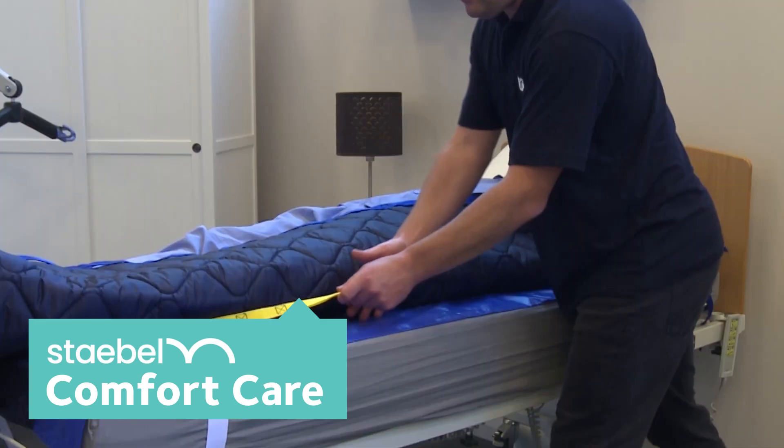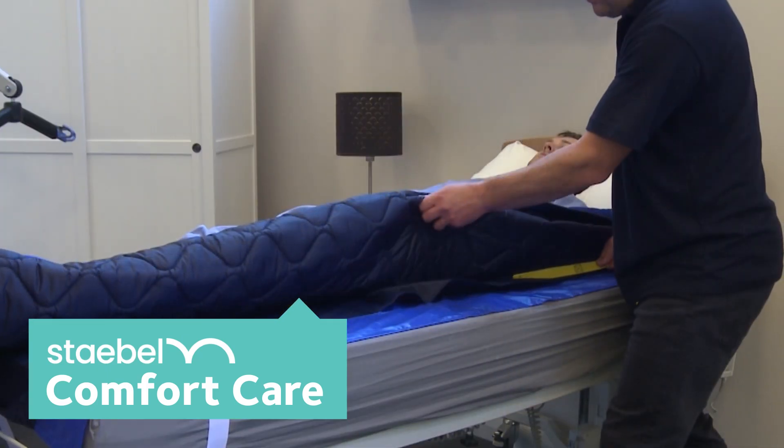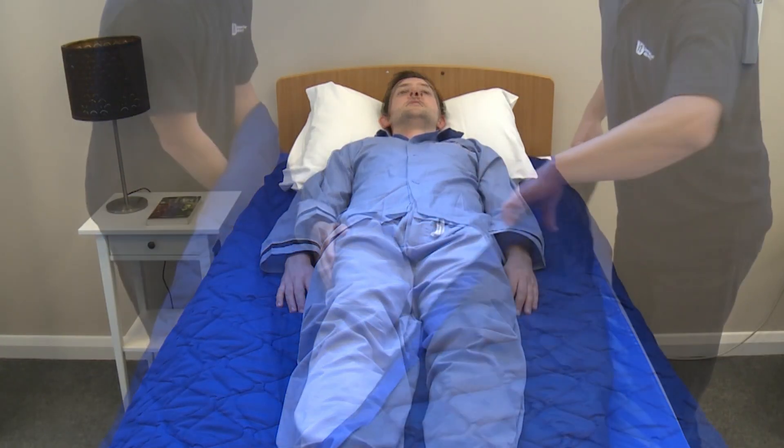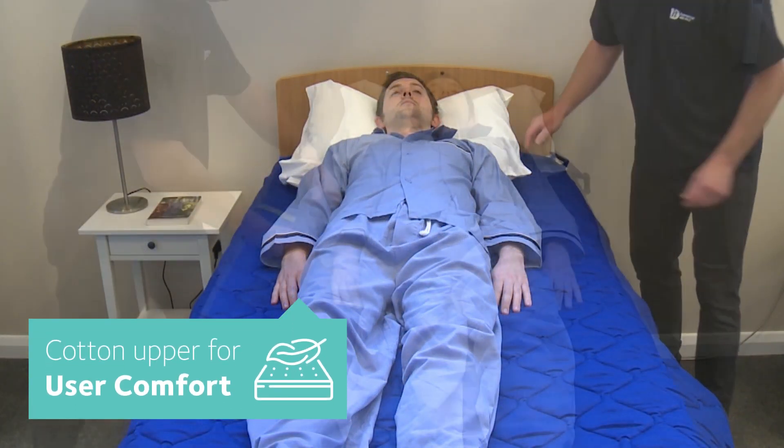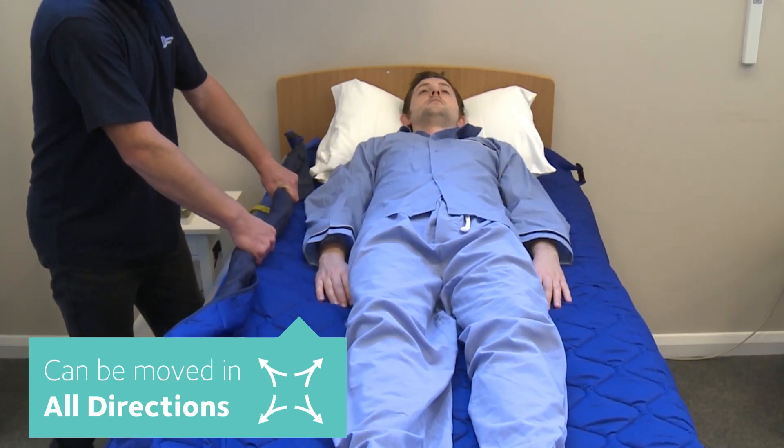Before moving a person, you must ensure the base cover is slippy. To do this, holding the yellow handle of the slippy cover located on the base sheet, gently pull it towards the head end of the bed to cover the anti-slip panel. Repeat on the other side.